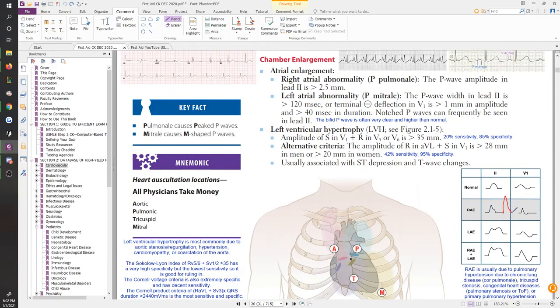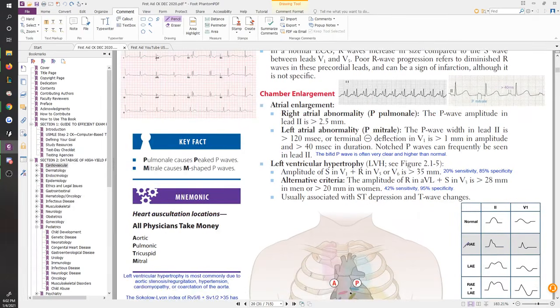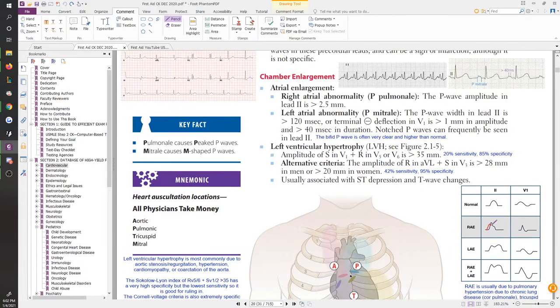going to have the QRS complex and it's almost equally as tall. That doesn't happen. Shouldn't be that tall. With the left atrial enlargement, mitrale, you get a very clear M. Okay, so don't be too confused about it. You do get something that looks like somewhat of an M in the right atrial enlargement as well, as you can kind of clearly see that you can write an M over that, right?